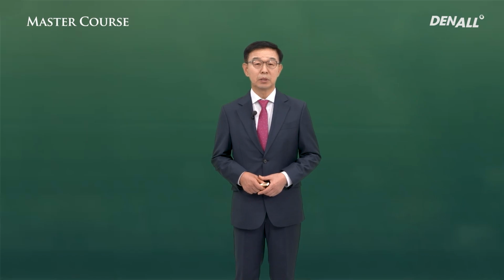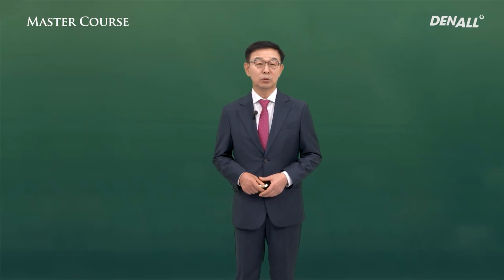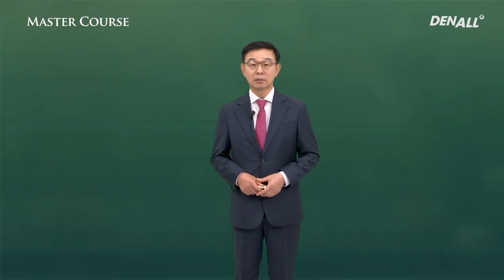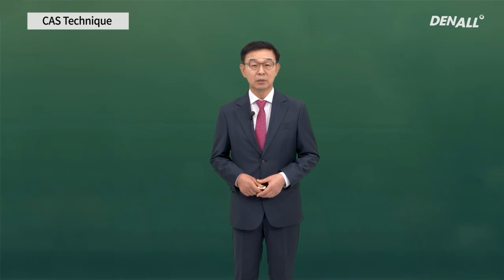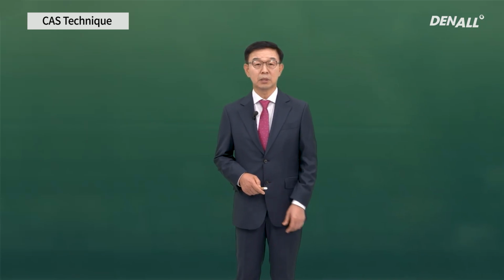The method is comparatively simple and patients recover quickly. Both dentists and patients are very satisfied with this approach. I'm going to talk about the indication and ways to use the CAS kit, which is most suitable for the crestal approach.